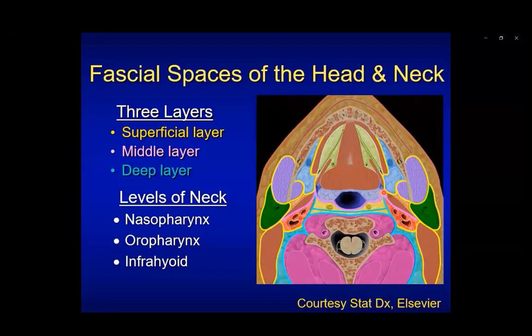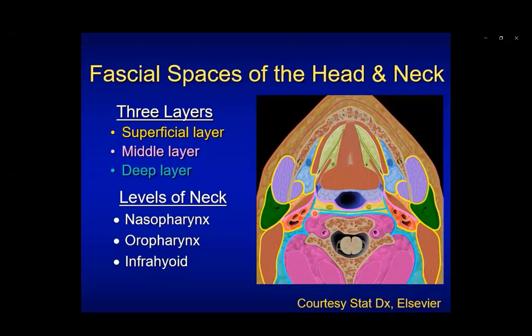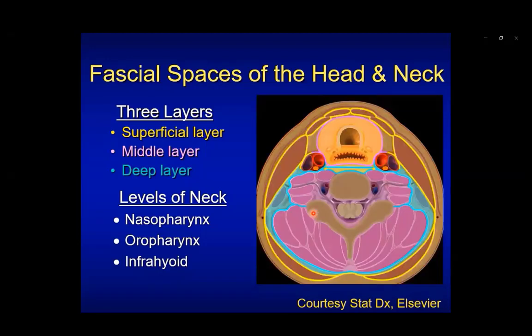At the level of the oropharynx, the superficial layer of deep cervical fascia in yellow surrounds the masticator space, parotid space, and musculature. The middle layer runs along the posterior margin of the oropharynx and the anterior margin of the retropharyngeal space. The deep layer in blue involves the retropharyngeal and dangerous spaces, as well as the perivertebral spaces. In the infrahyoid neck, the superficial layer runs along the musculature, the middle layer in pink surrounds the viscera, and the deep layer in blue runs along the retropharyngeal and perivertebral spaces.